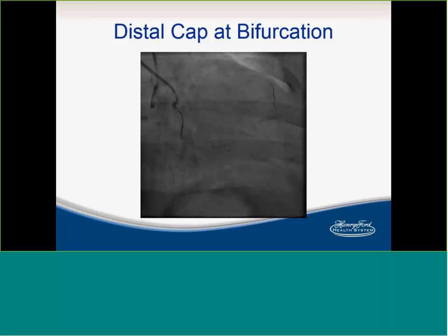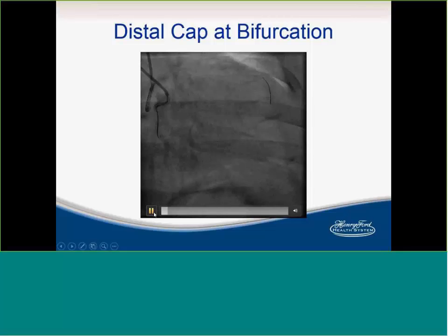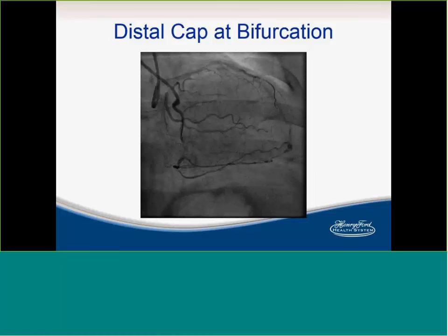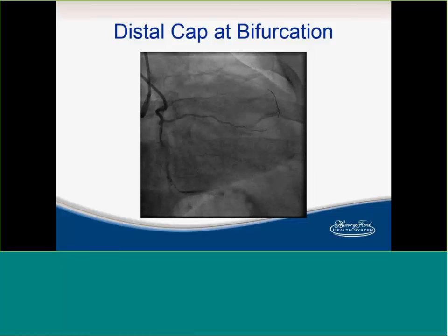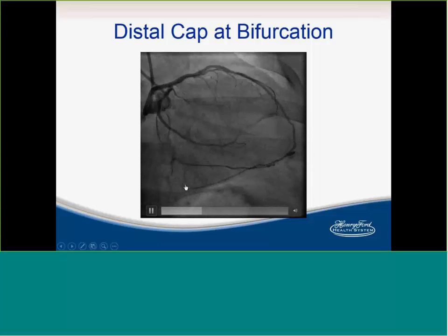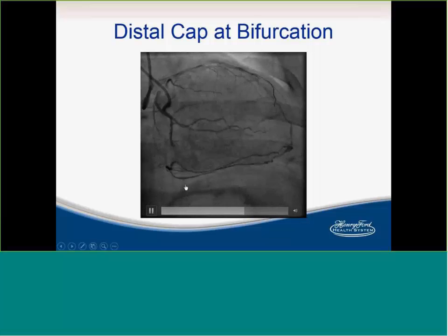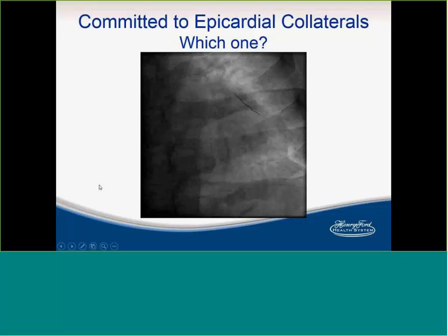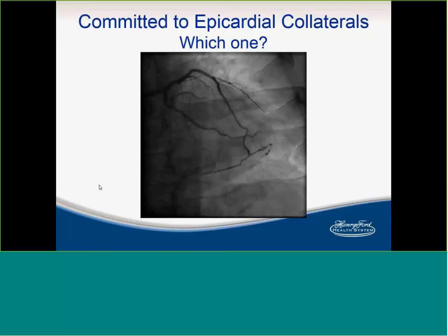And a hybrid CTO score, I think also 3, right, Manos? Yeah, I agree. The good news is you do have an interventional collateral, because it's one you could probably do, not for everyone, but I think experienced operators can do it. And then you have a tortuosity, which is an adverse parameter. It's not a circ, so you don't get that one. So that would give you a number of 2, I guess. Yeah. No, there was a previous attempt, and it wasn't a factor in the hybrid.